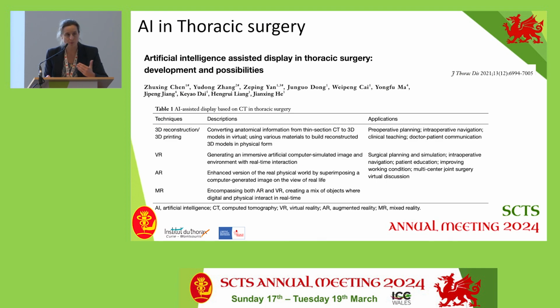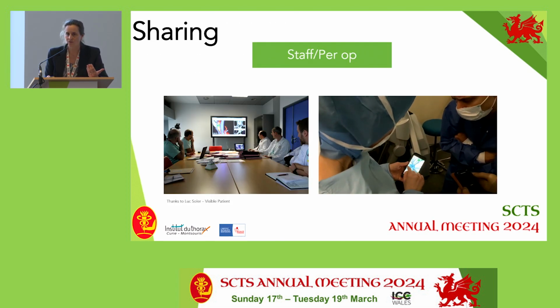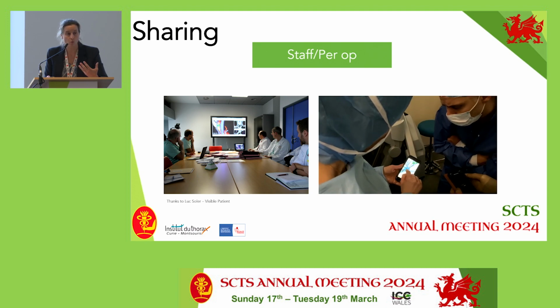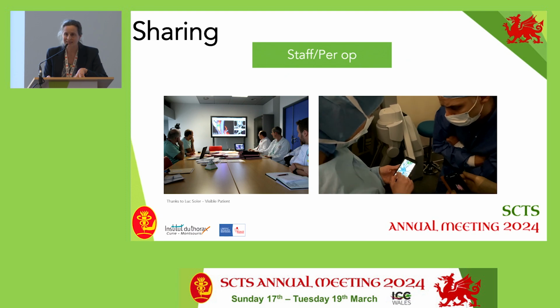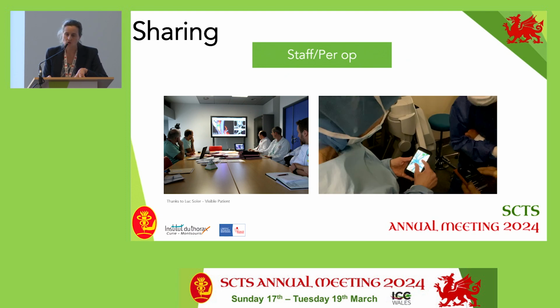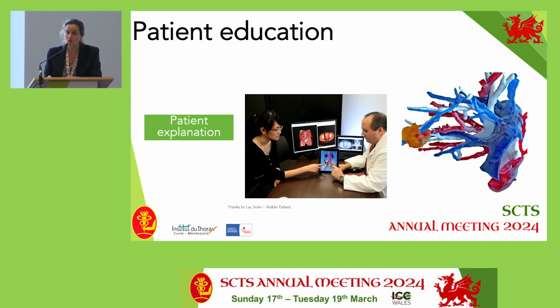And there's a lot of publications coming with these 3D models and what we can use with the 3D models, like sharing during our staff meeting with the others to explain why we want to do this segmentectomy, sharing inside the operative room, also sharing with the juniors for their education, with a lot of playing games where they will be very aware of the anatomy, and sharing with the patients.